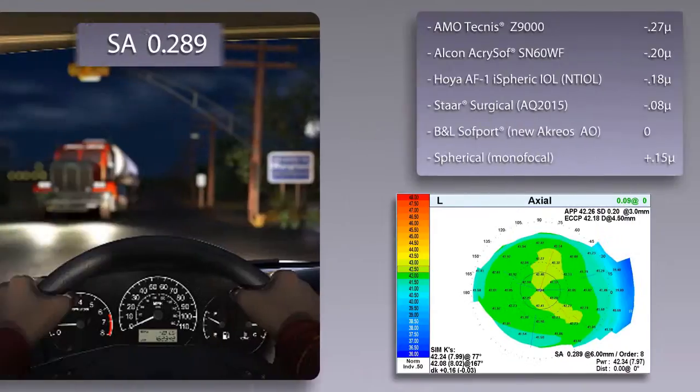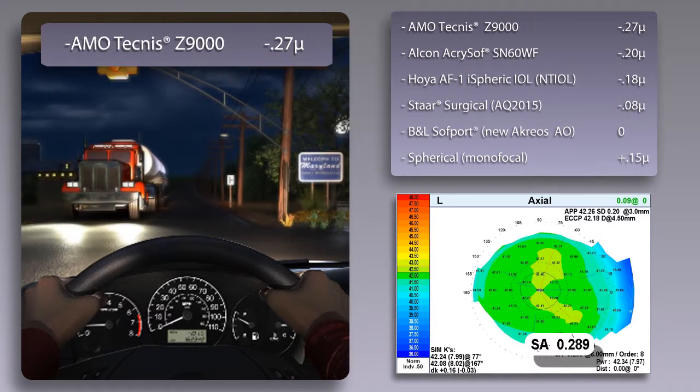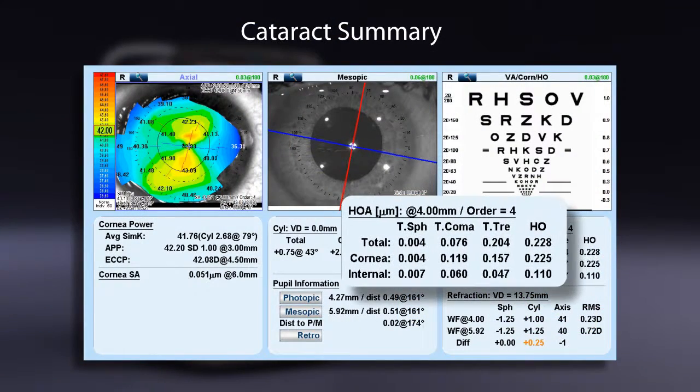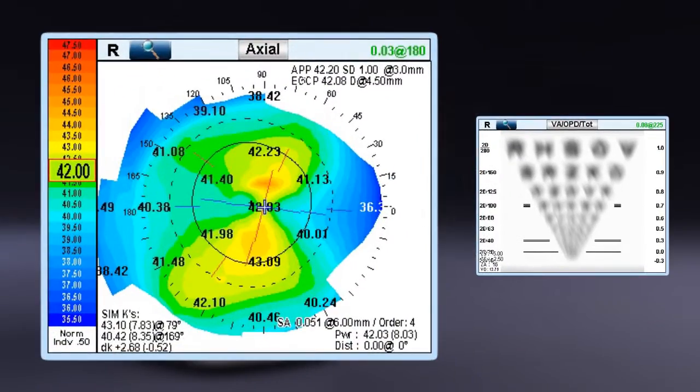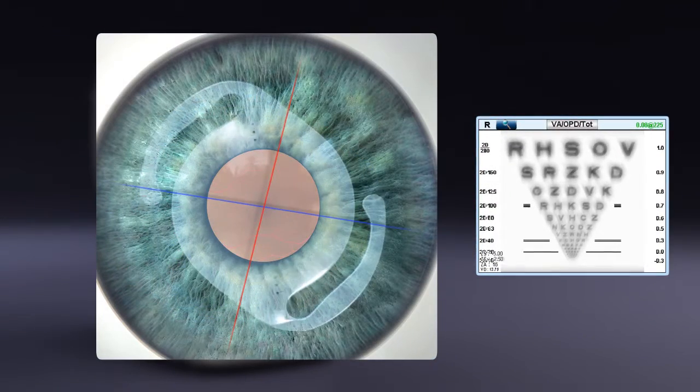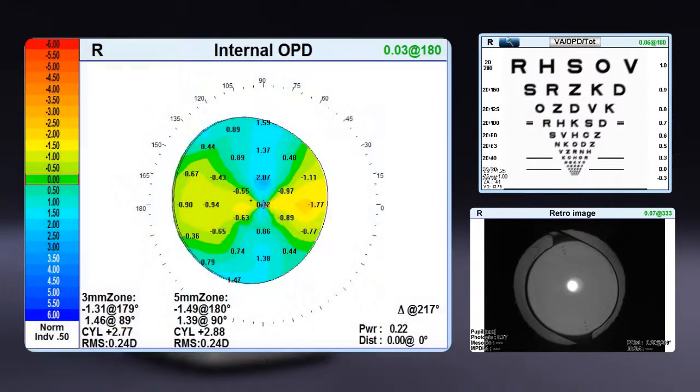IOL applications include spherical aberration of the cornea for aspheric IOL selection. Cataract summary displays any high-order aberrations that may remain after the cataract is extracted. Map view shows pre-op measurement with the ability to display the post-op measurements showing the correction along with the markings of the toric IOL in the retroillumination image, and lens placement with the internal OPD map.